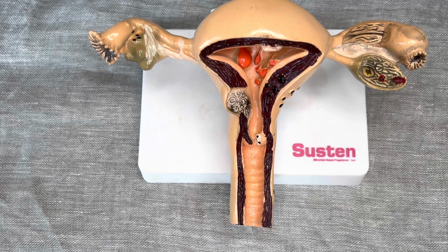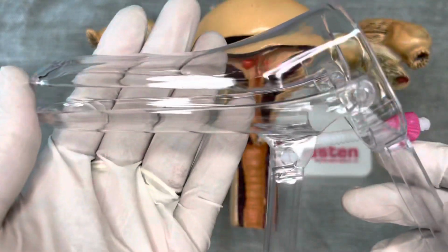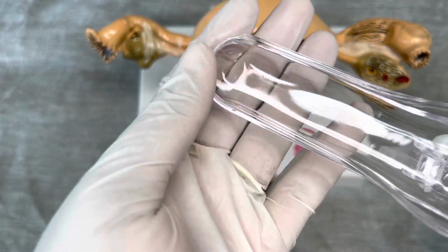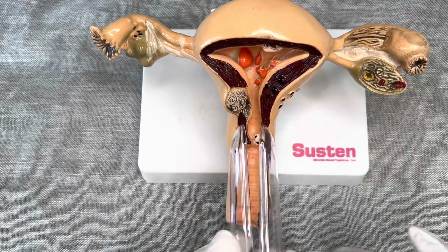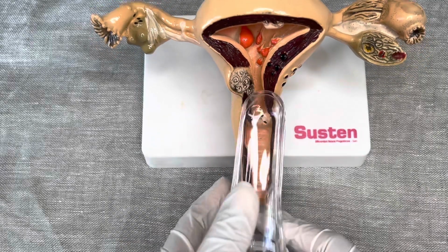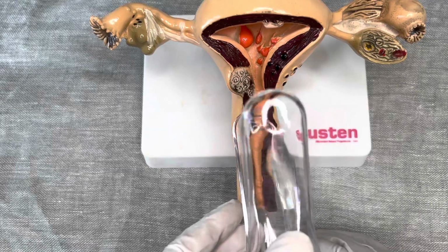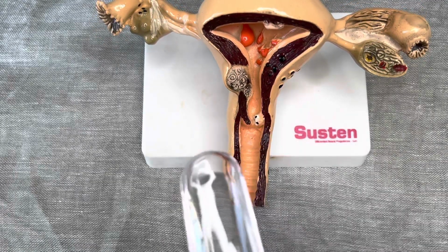you will have to use this instrument. It is called a speculum. Before we used to do it with metal speculums, but nowadays we have these very nice plastic speculums. So what normally happens, you insert this like this. I hope you can see, and then you turn it around like that, and then you open so that you can be able to visualize the cervix when you're in the vagina.